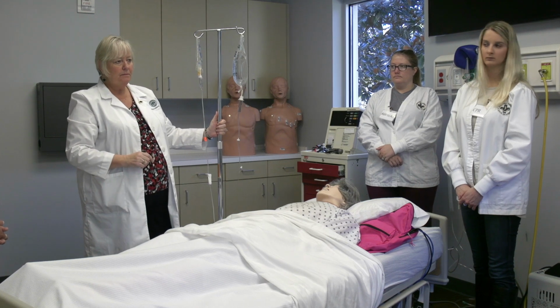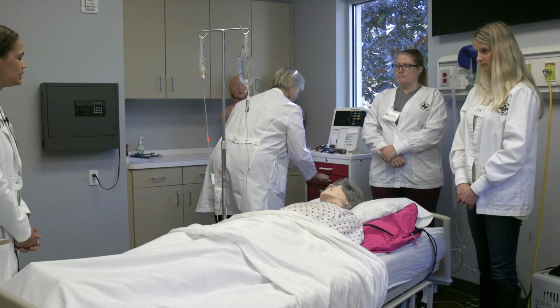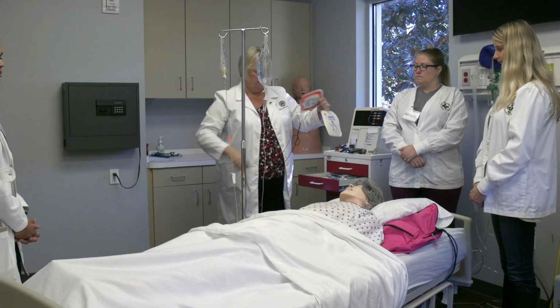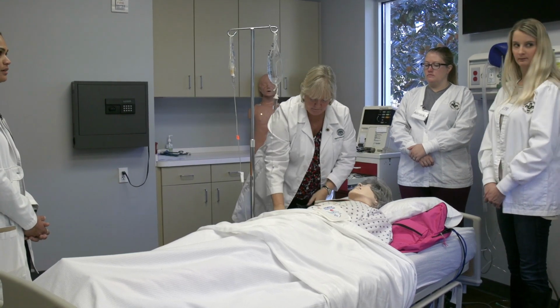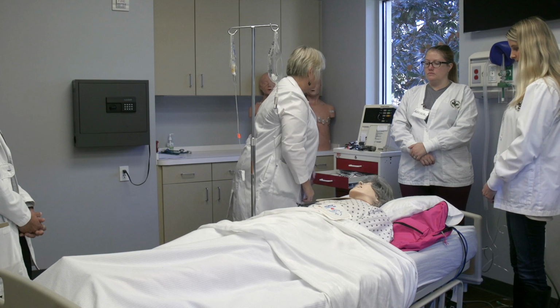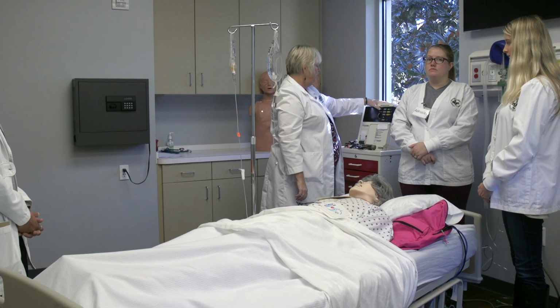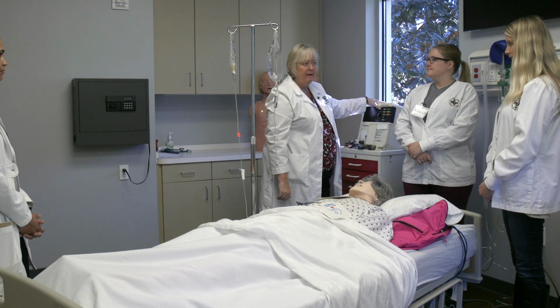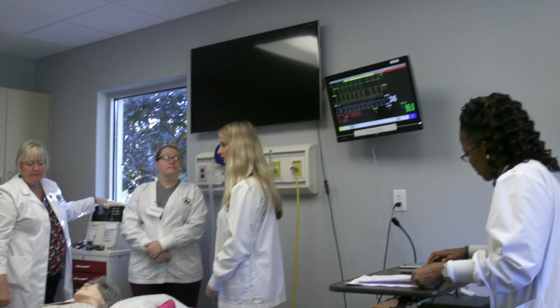Okay, so now we need to consider transcutaneous pacing. So if we could put the patches on her, please. We're going to set the machine to pacing. We're going to start at 50 milliamps, and then we'll increase until we see capture on the monitor, and that'll be evident by a pacer spike. Pacer is on. Pacer has defaulted to a heart rate of 70 and a milliamp of 50. I see capture. All right.